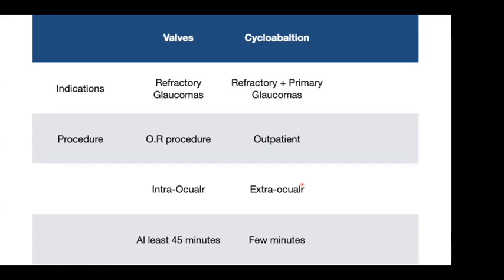I did stop practicing valves, because I know that I can have lots of complications following valve implantation. Also I published in the Egyptian Journal of Ophthalmology, together with my colleague Dr. Halal Hilali, on the complications of the Ahmed valve. We applied the valves mainly in the pediatric age group and some others, and definitely we reported a lot of complications. So that's why I was away from the valves.